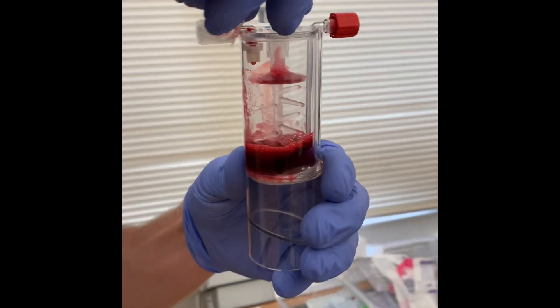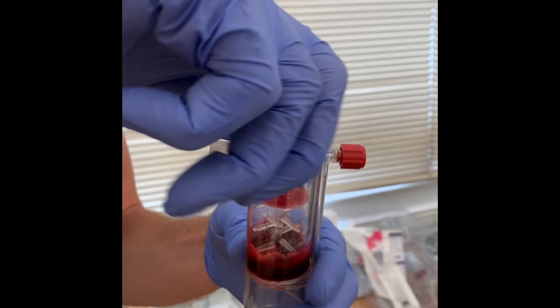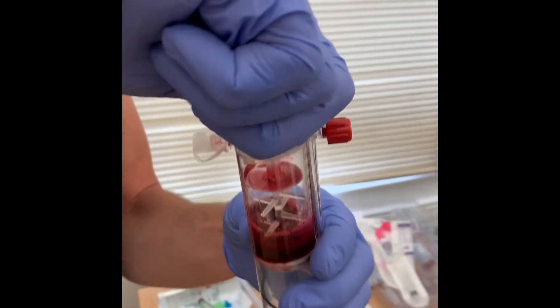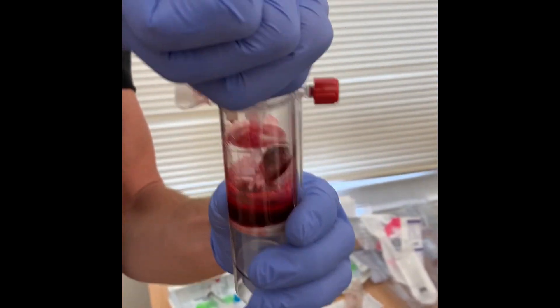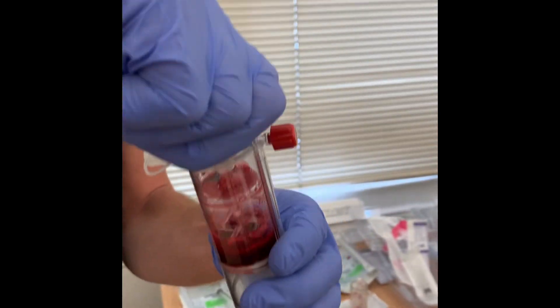So in here there's some polyacrylamide beads. Let's just mix them up. They get filtered out in this process so they don't go into the patient, but they work as a bit of a sponge — to absorb more of what we don't want to give the patient.